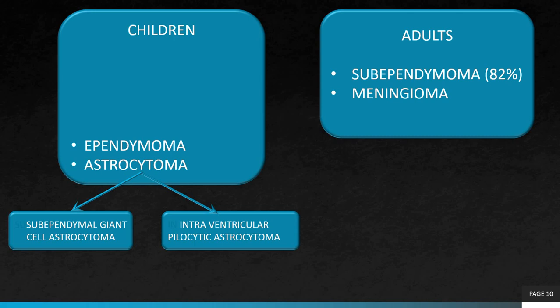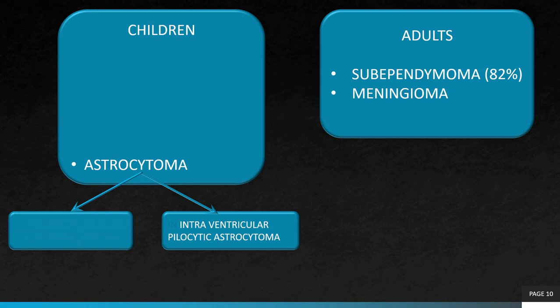Ependymomas have cystic components with small chunky calcification and heterogeneous enhancement, so they also appear less likely. Sub-ependymal giant cell astrocytoma appears less likely as they are periventricular in location and are often associated with tuberous sclerosis. It cannot be a meningioma as the patient is a child and the lesion does not enhance. So we are left with two possibilities: first, intraventricular pilocytic astrocytoma, and second, sub-ependymoma.